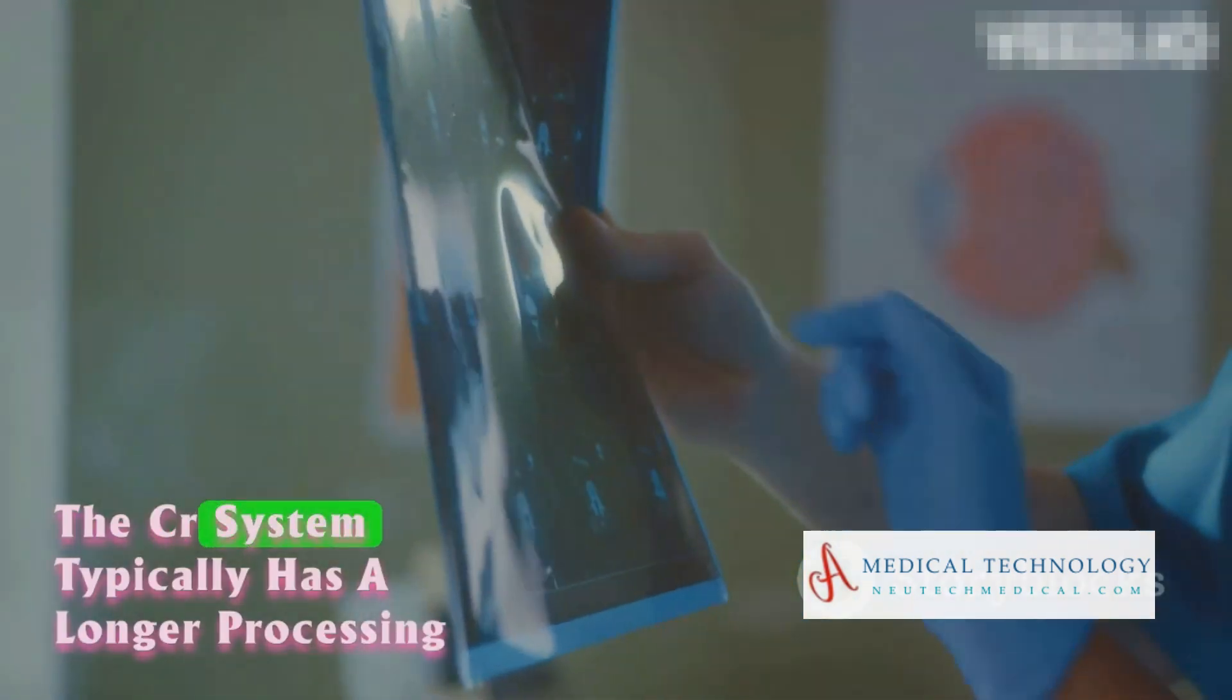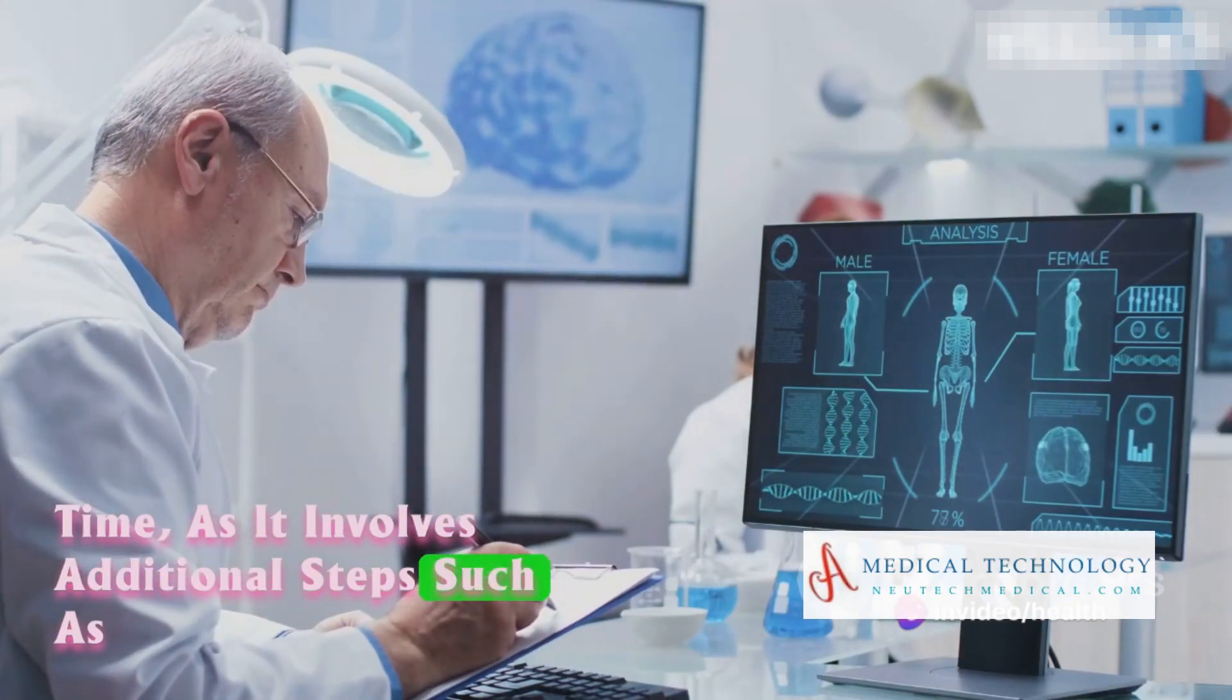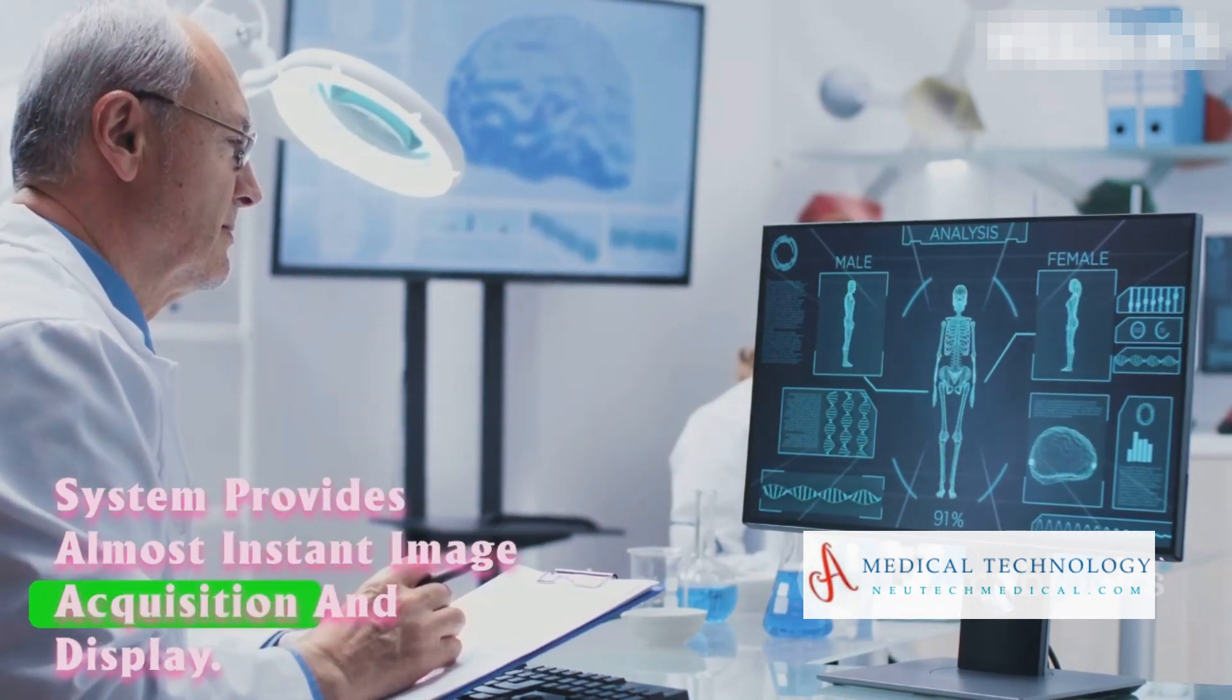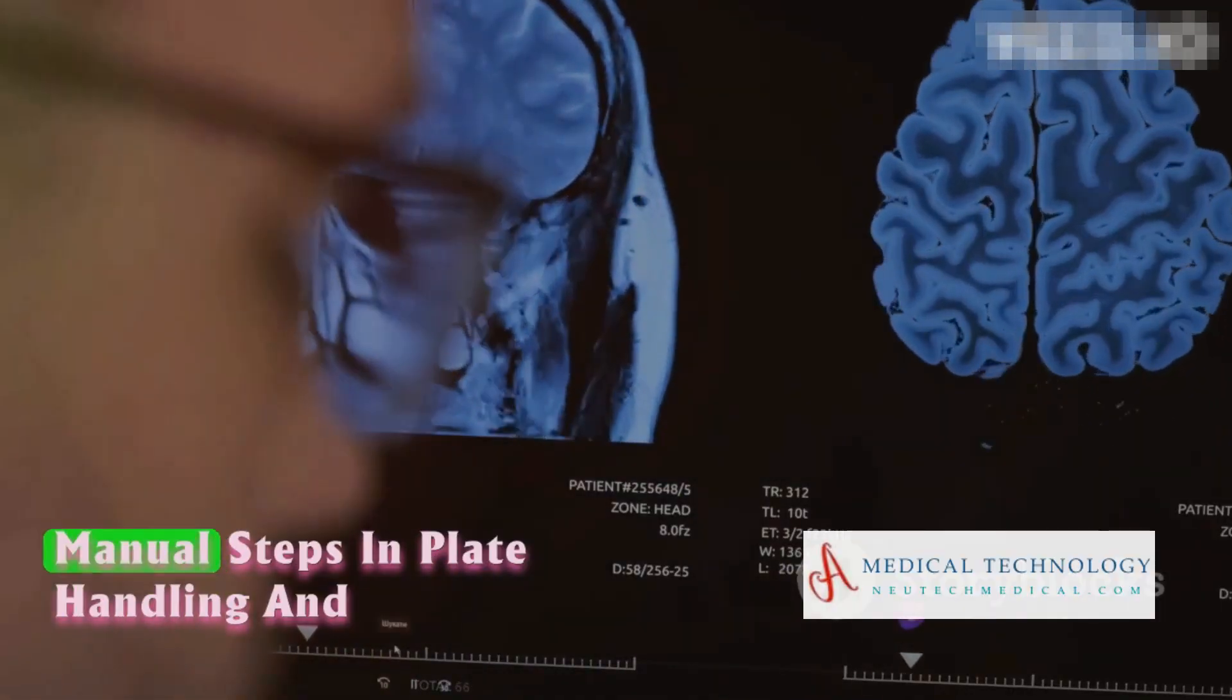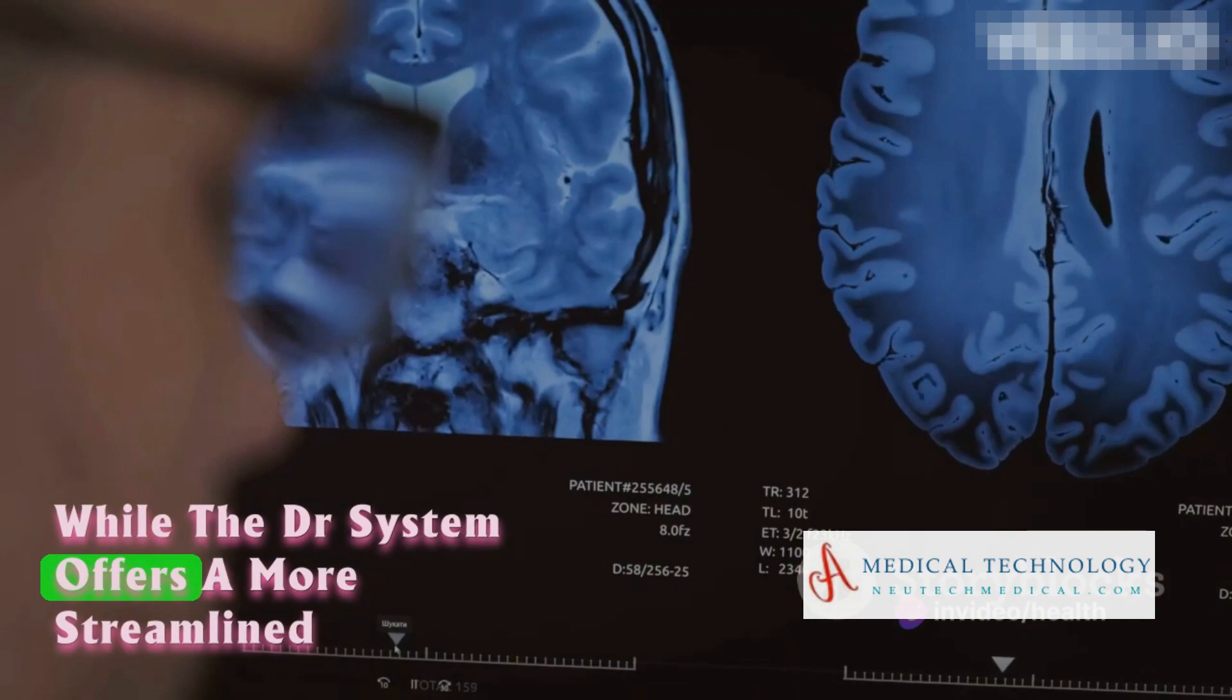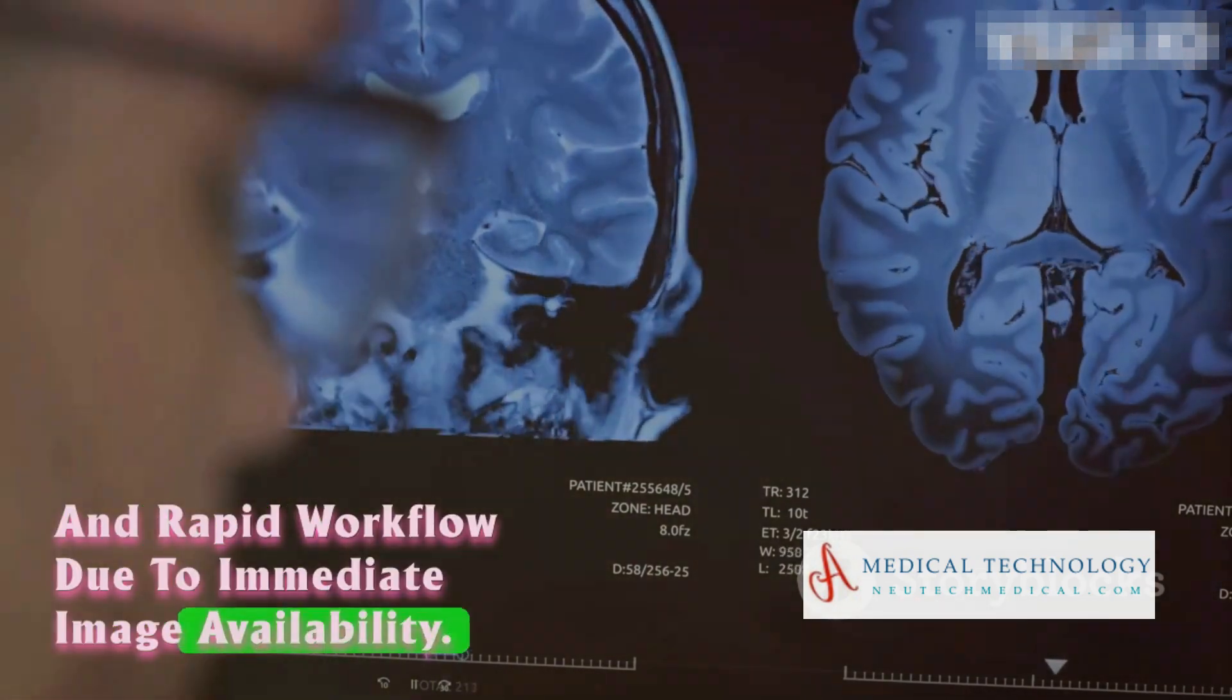The CR system typically has a longer processing time, as it involves additional steps, such as plate scanning and laser reading, while the DR system provides almost instant image acquisition and display. The CR system may require more manual steps in plate handling and processing, potentially impacting workflow efficiency, while the DR system offers a more streamlined and rapid workflow due to immediate image availability.